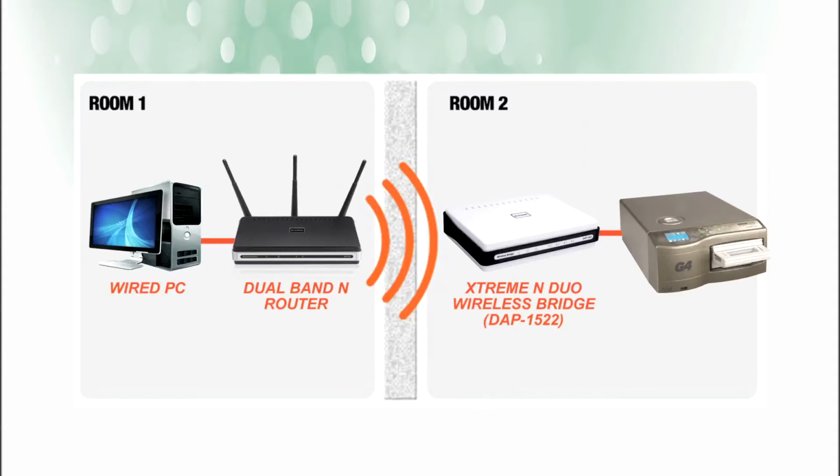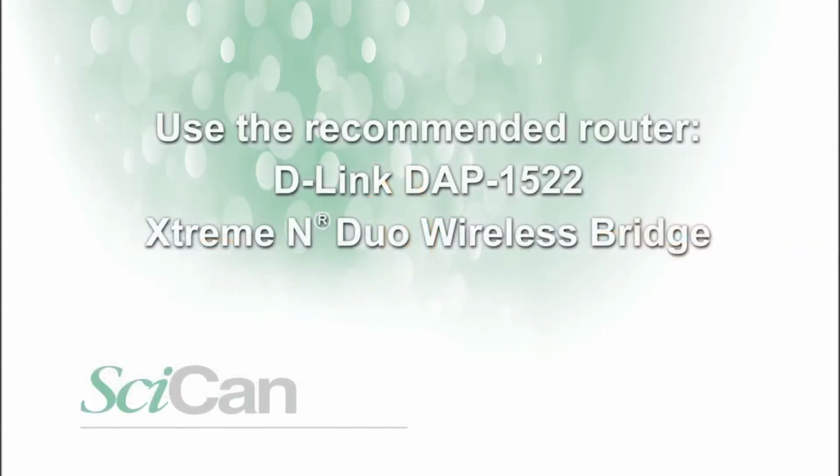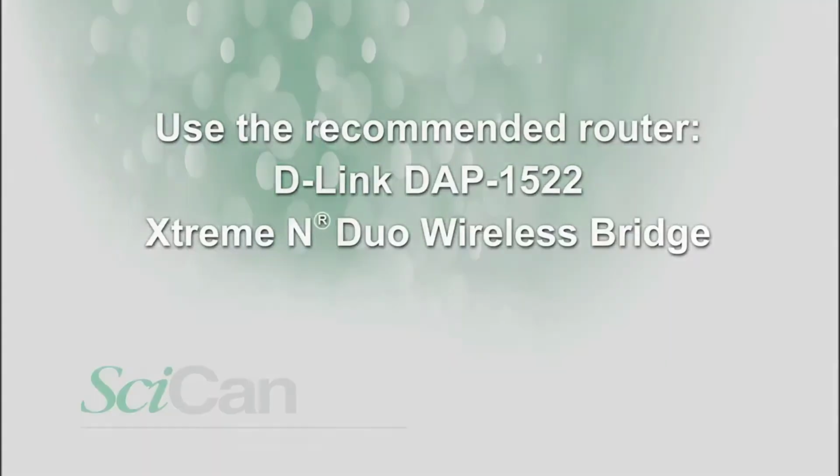by connecting the Ethernet port to an external wireless bridge access point. SciCan currently recommends the use of the D-Link DAP 1522 Extreme N-Duo wireless bridge. Contact your network administrator to learn more about setting up a wireless bridge.